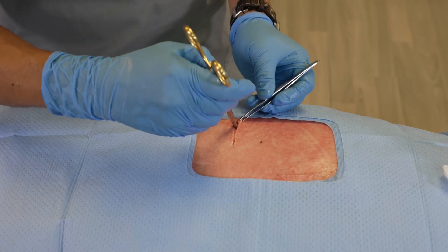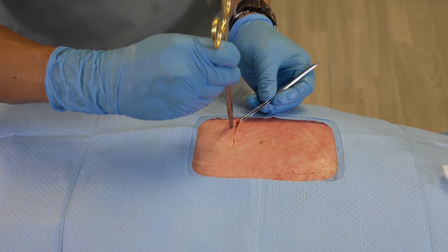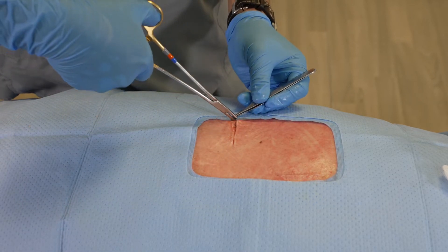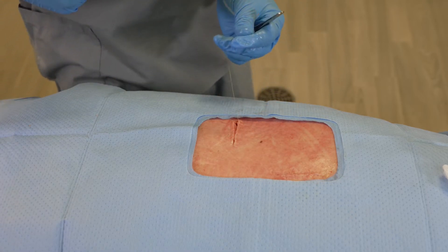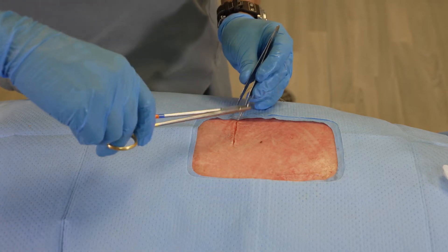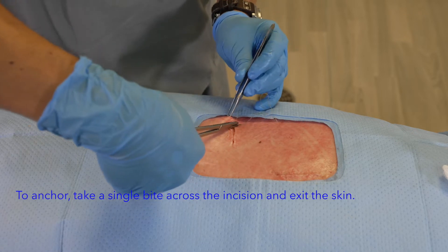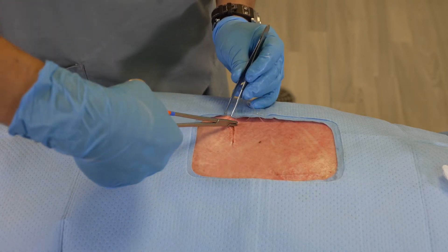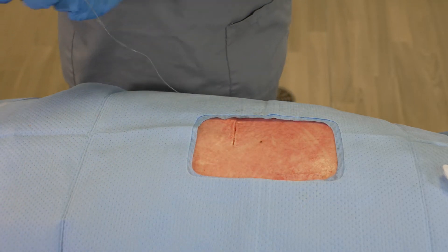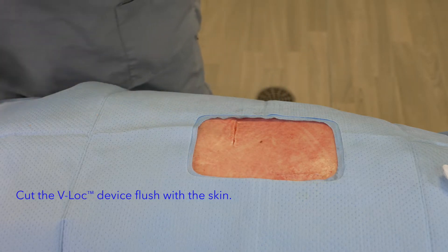This will be my final portion of this run. At which point, I'm going to take the needle, pass it through the skin — and you can see that within a matter of a few minutes, my first layer is already complete.